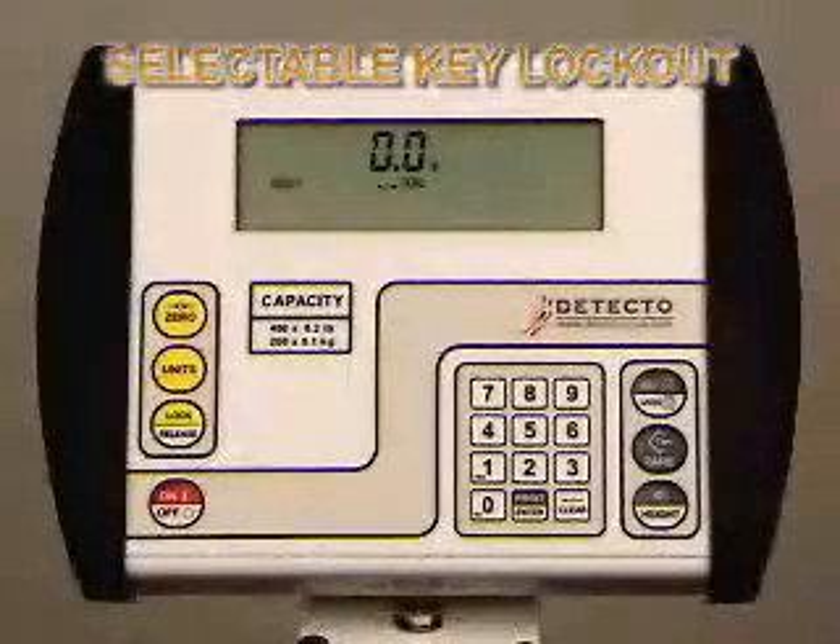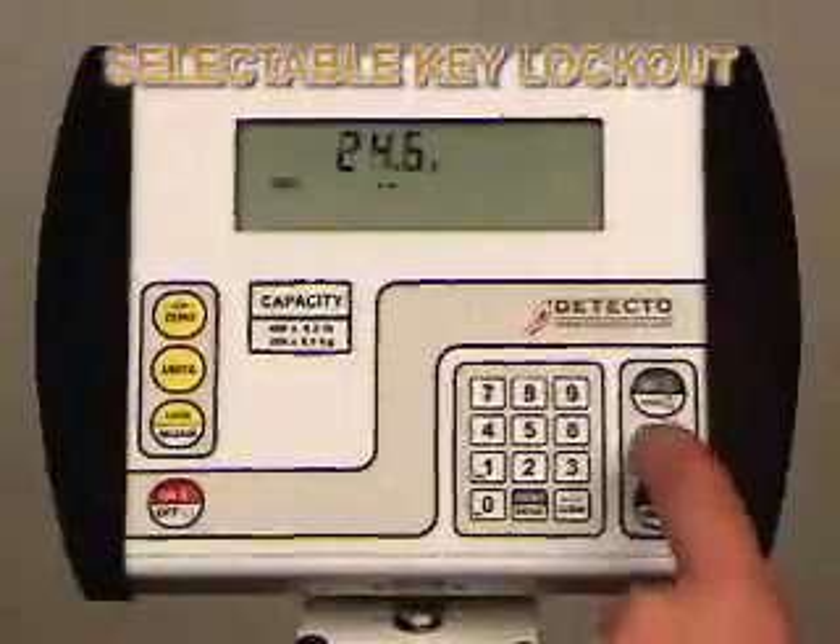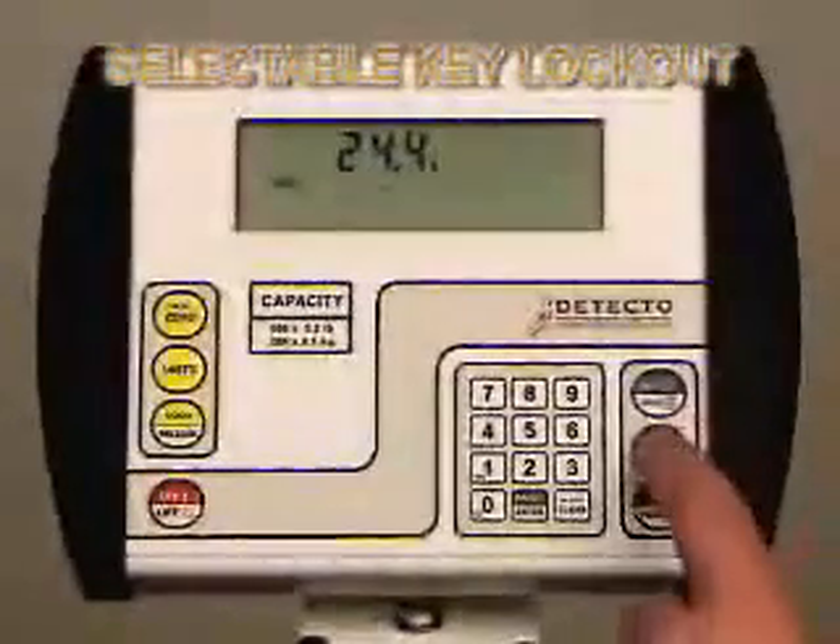Toggle through the remaining calibration modes until you get to Done and then hit Enter. The indicator will go straight to Weigh mode. As you see here, the Net, Gross, and Tear keys are locked out now.